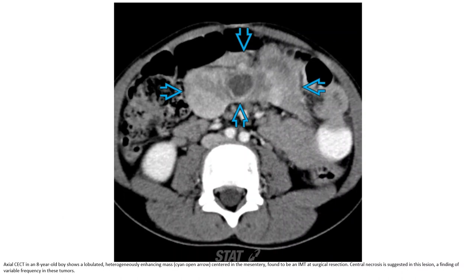Coronal and axial CT in another patient shows a lobulated, heterogeneously enhancing mass centered in the mesentery, found to be an IMT at surgical resection. Central necrosis is suggested. Variable frequency of this finding is noted in this region.